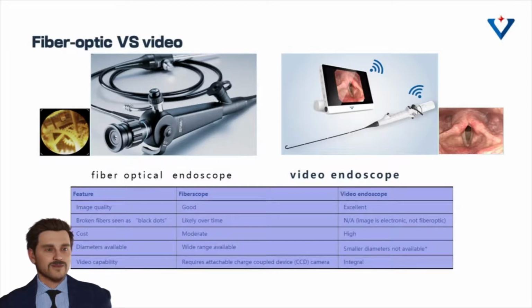Video borescopes, on the other hand, are far more shock resistant than fibroscopes. This means that they can be easily bent, folded and maneuvered without damaging them. This is also why they have articulating capability that is far superior to fibroscopes, so much that a user can turn the tip of his device backwards if he needs to.